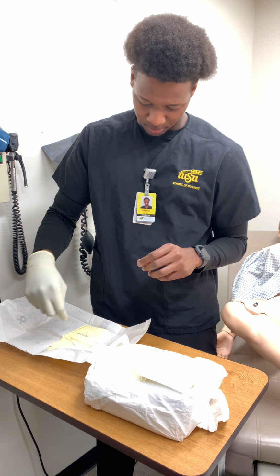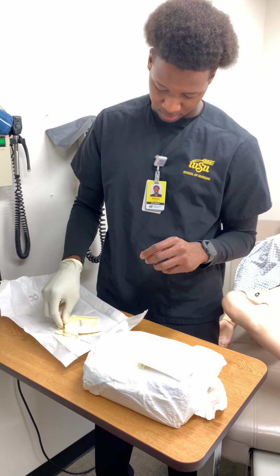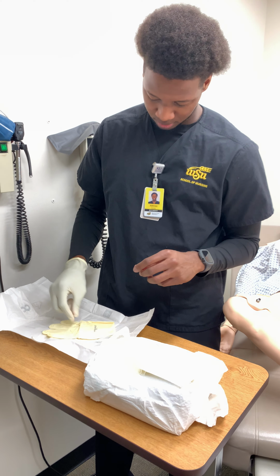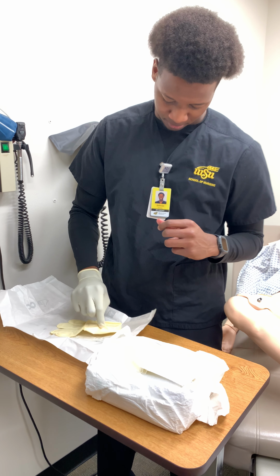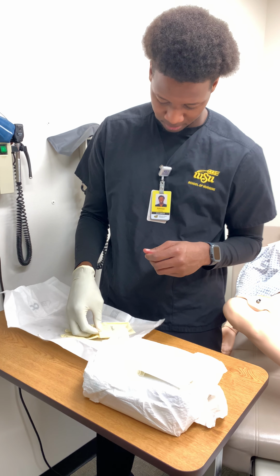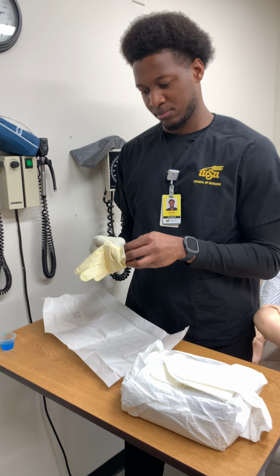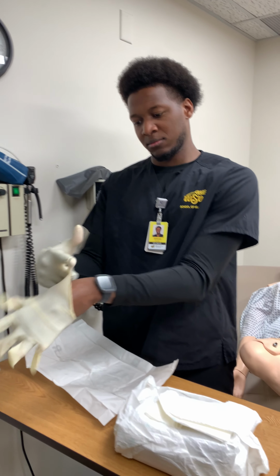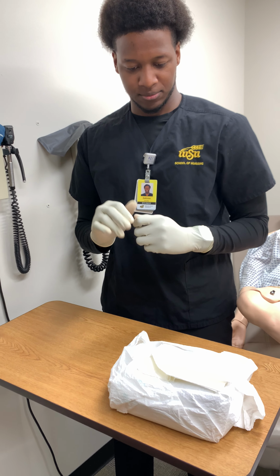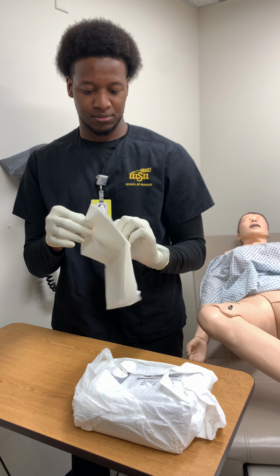To get that one on, I'll come over here and get this one on. Dispose of that. Then starting this Foley insertion off, drape the patient.